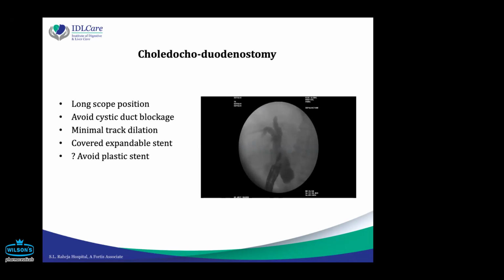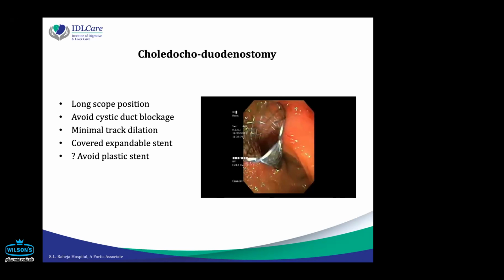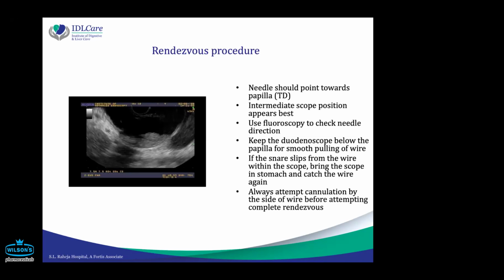of cholecystitis. Because the stent is going to be a fully covered metal stent, you have to see that it is not covering the cystic duct. Same steps, passing the wire, passing the dilator, and putting a stent. In this case, we are placing a fully covered metal stent. Of course, you have EUS specific stents available now, Axios is available, Spaxus is available. So straightforward procedure, provided you get a good access. So getting a good access and getting a good scope position, two important things before you puncture.